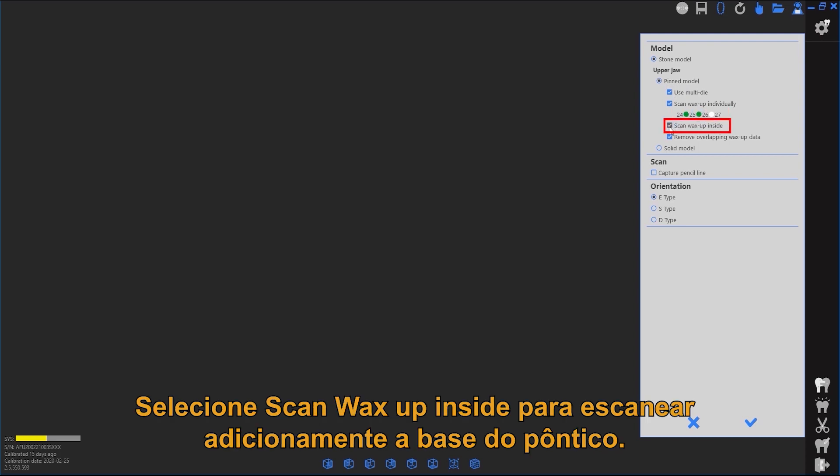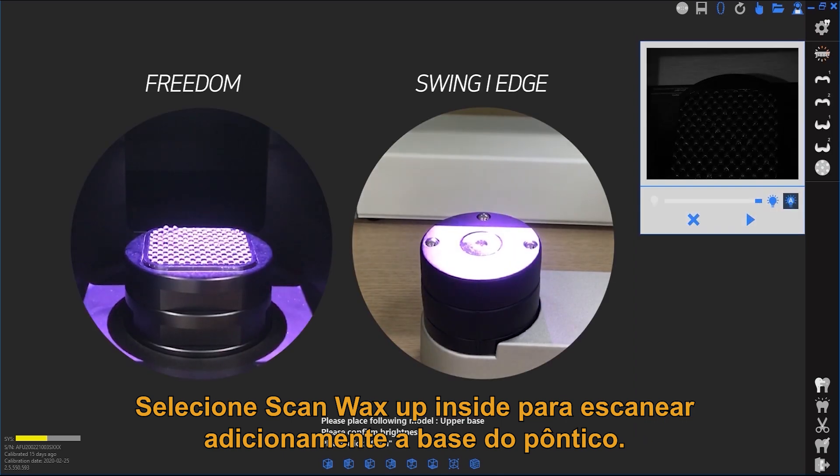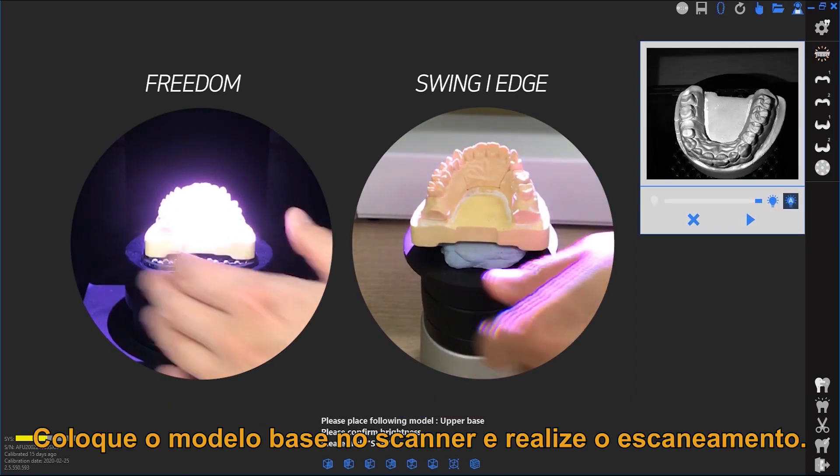Select to additionally scan the pontic base. Then place the base model in the scanner.